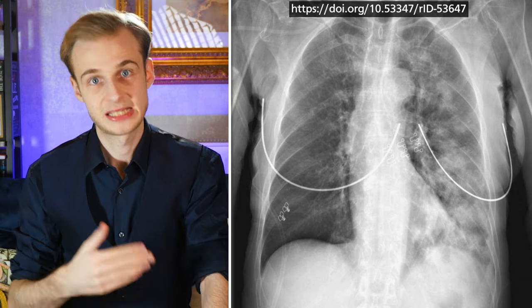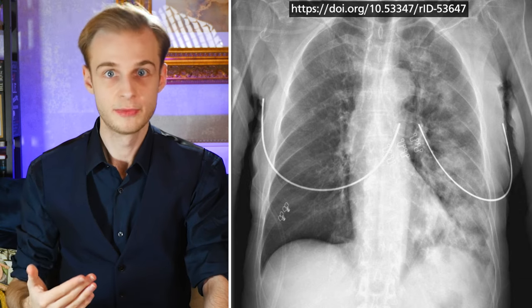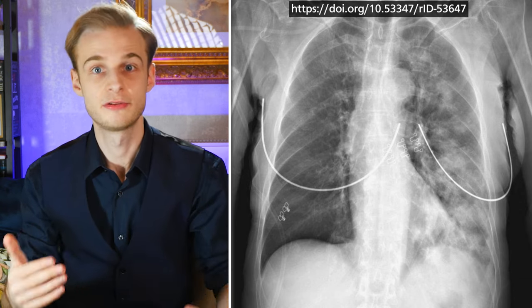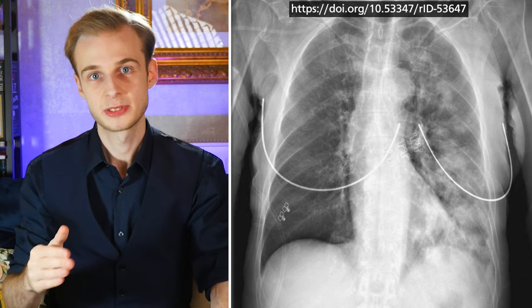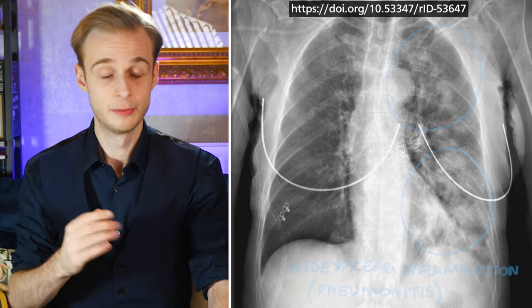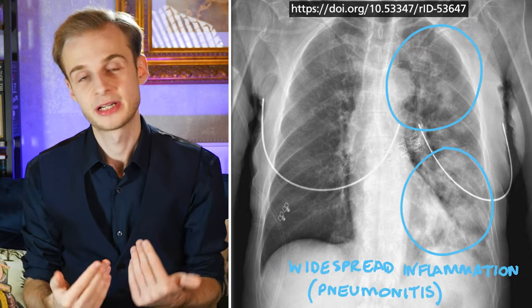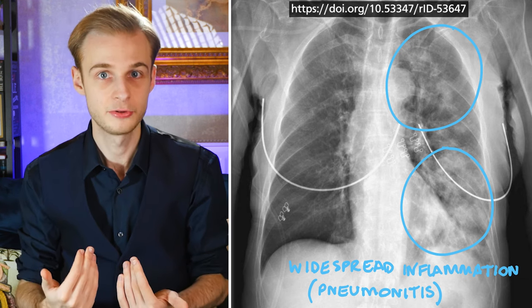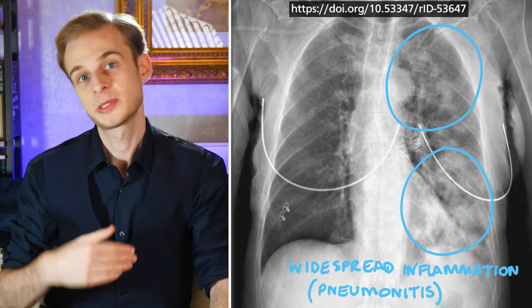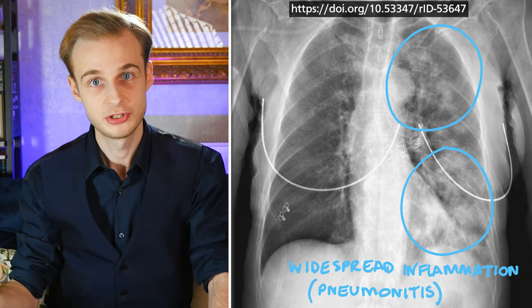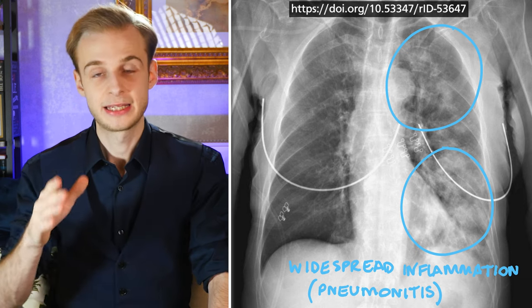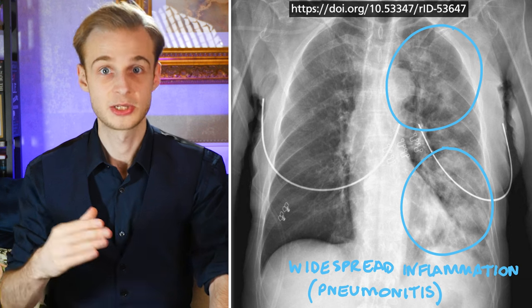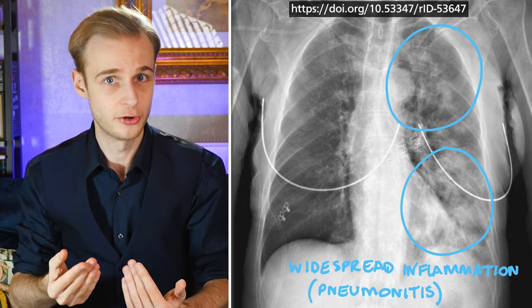Here is an example of an aspiration pneumonia, where solids or liquids are aspirated into the respiratory tract. Erect patients — those who are sat up or stood up — are more likely to have aspirated substances move into the basal and middle lobes, whereas a recumbent patient, such as somebody lying down post-surgery, is more likely to have the posterior part of their upper lobe affected, as well as the superior part of the lower lobe.